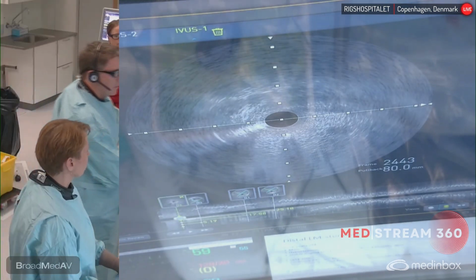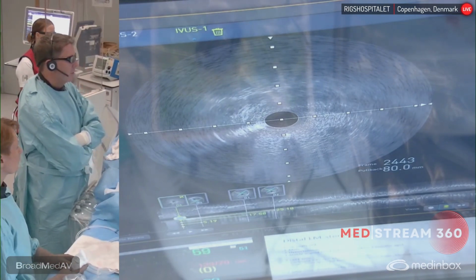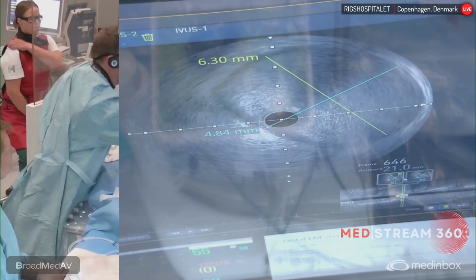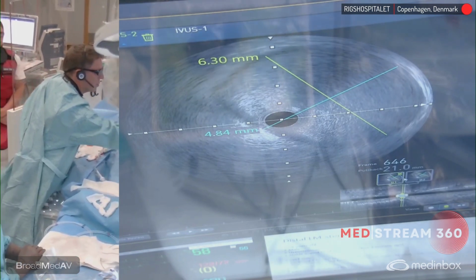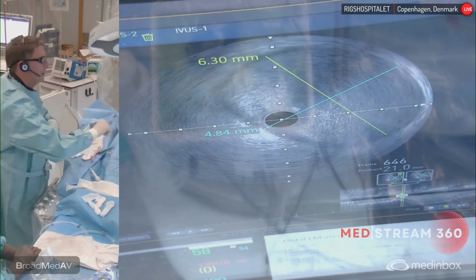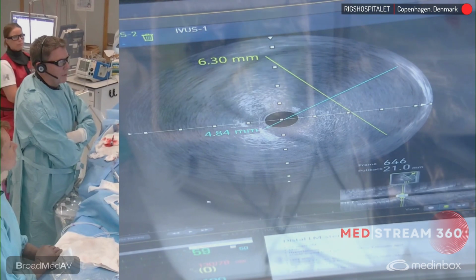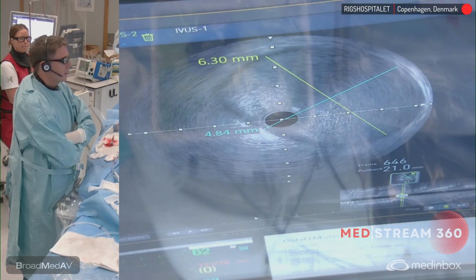The thing to consider here is whether we actually think that we can dilate the vessels and have a good stent expansion and position. We have some areas, as you can see on the screen, where we have some dilatation of the proximal circ, and we have a very huge proximal LAD as well. So whether we can actually cover it with the stents, we go with the largest stent, so it can go up to 6 millimeters. But if we are not sure about this, we should probably aim for CABG instead. That's what my colleague is right now discussing with another colleague.